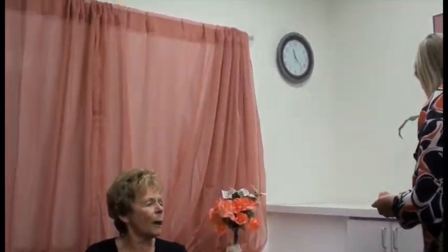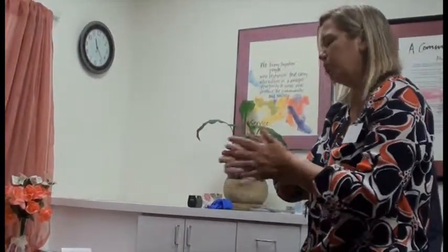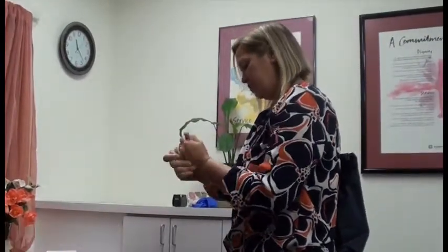I am. I'm going to start setting things up because the first thing I want to do with you today is take your vital signs. So I'm going to turn on my computer, let that warm up for a second. Need me to push my shirt up? Sure, you can get that ready while I wash my hands rather quickly. And then I'm going to set up a little thing to take your blood pressure, see how things are going with you. There you go. Thank you.